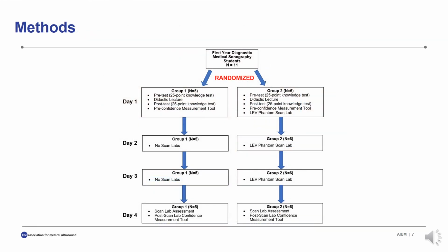11 first-year diagnostic medical sonography students were recruited to participate in this study and were randomized into two groups. Group 1, N equals 5, received the standard curriculum. They were given a 25-point multiple choice pretest, a didactic lecture, and a 25-point post-test. During the lecture, a demonstration of the imaging protocol was performed by the instructor.